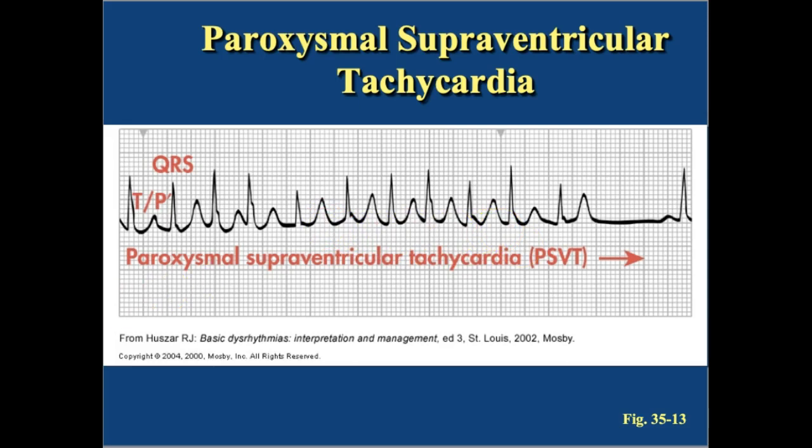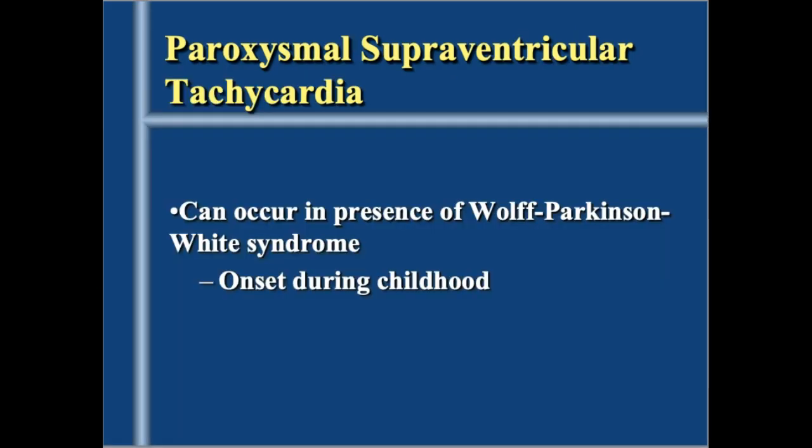And that's what we're telling you. It's a paroxysmal supraventricular tachycardia. This is one of those rhythms that we'll see in Wolff-Parkinson-White, and we already talked about this a little bit. It's some kind of tachycardia. It's occurring in the atria, and too many beats are being conducted down to the ventricles, so we've got a tachycardic syndrome, and we want to get this fixed because we don't want this continuing.